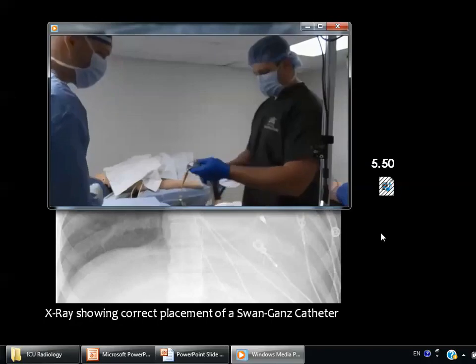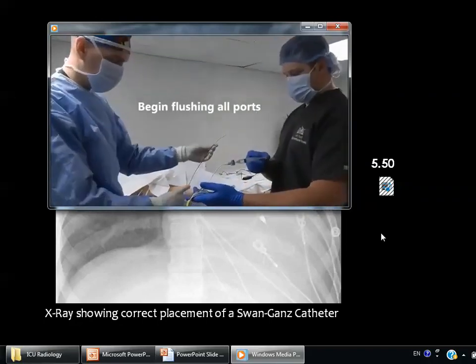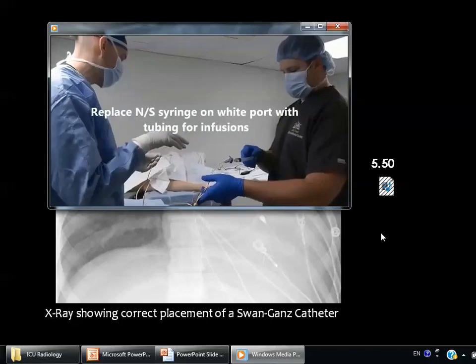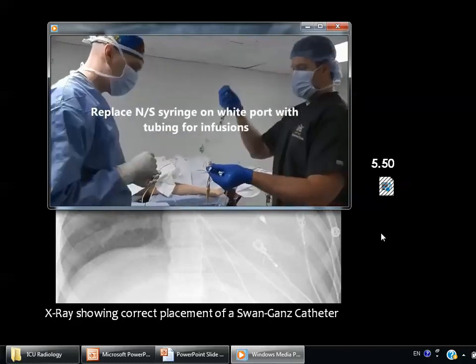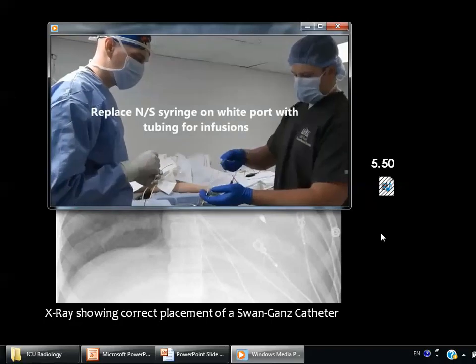Okay, go ahead and flush my white port, please. And I can see that it's flushed. Okay, so now that that's flushed, go ahead and hook up my infusions. My infusion tubing here to the stopcock. I'll open the stopcock.